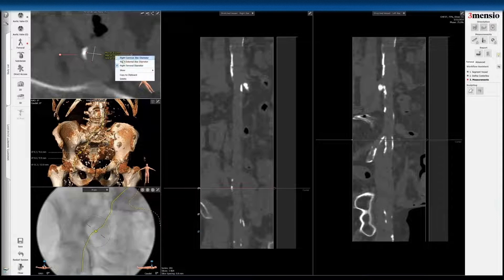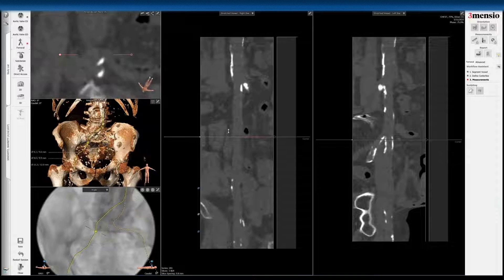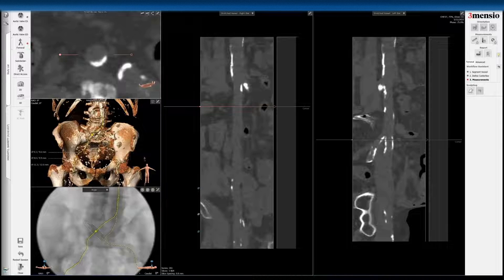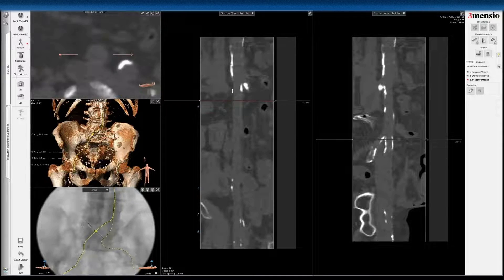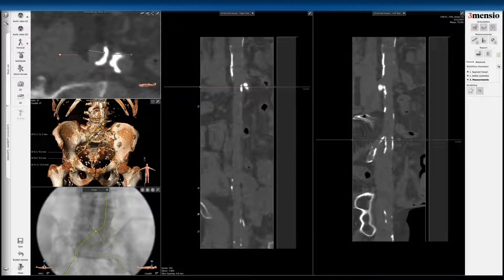So this is external iliac. I typically mark a lot of these landmarks, especially if there's a lot of calcium or concern about access challenges — in terms of whether you need shockwave lithotripsy, or you might need balloon angioplasty of a certain segment — and also so that you have enough landing room for your stents. So now I'm doing the right common iliac artery. You can see the rest are pretty straightforward. As the bifurcation comes out, it can also be very calcified, so you want to mark that as well.